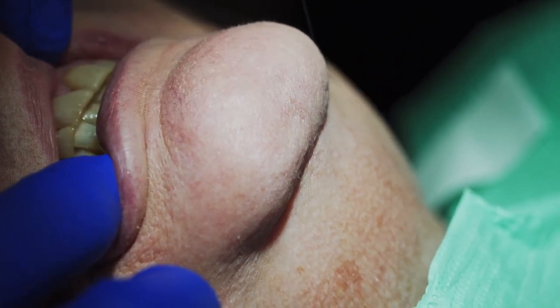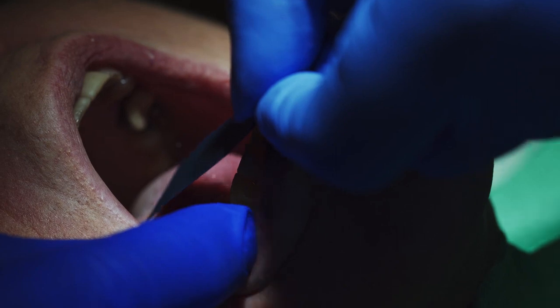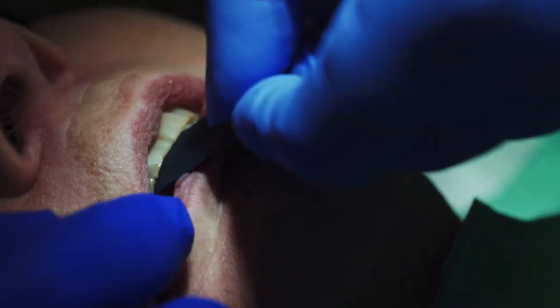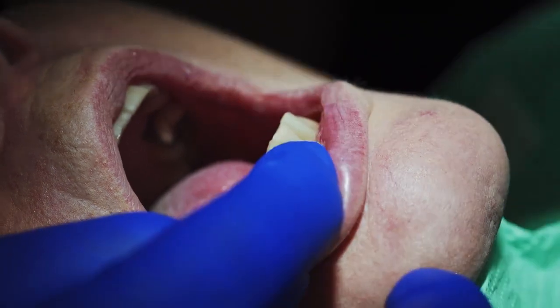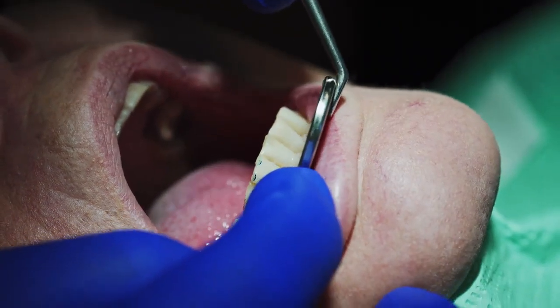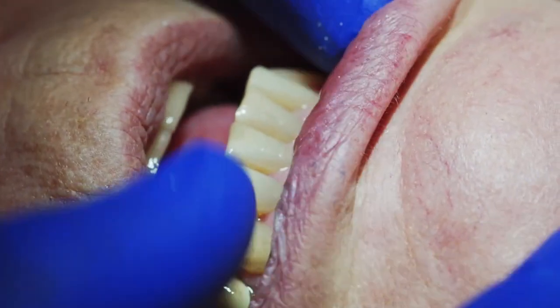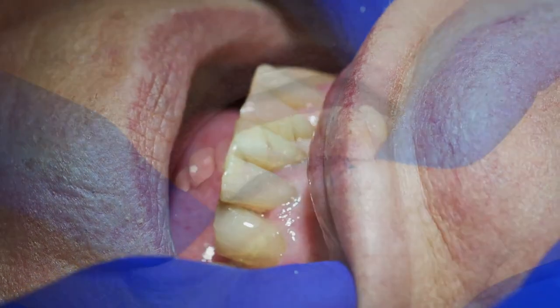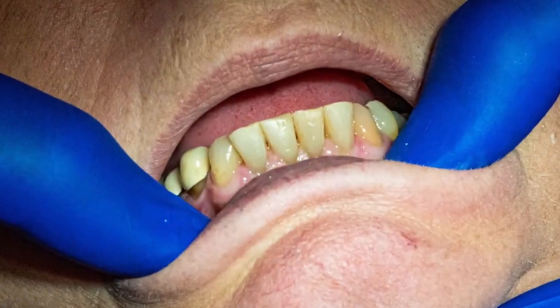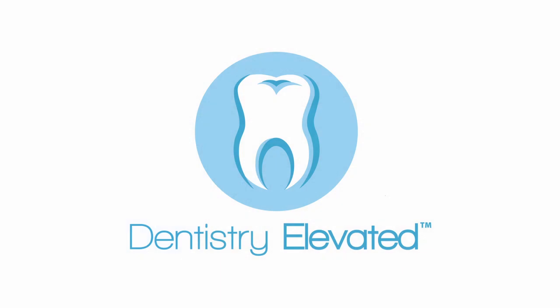Can you see it? Does it feel a little tall? It probably does. I'm just going to have you tap and grind on this paper I have in your mouth — go ahead and close, bite and grind. Perfect. Now we'll polish it and she is done.